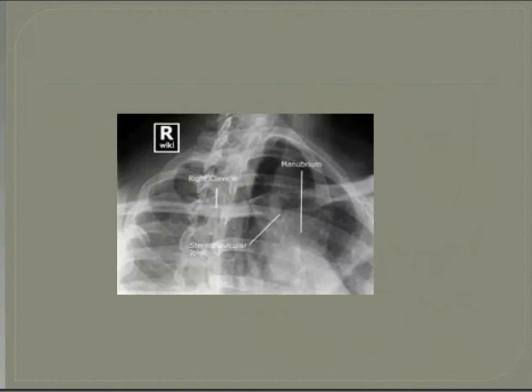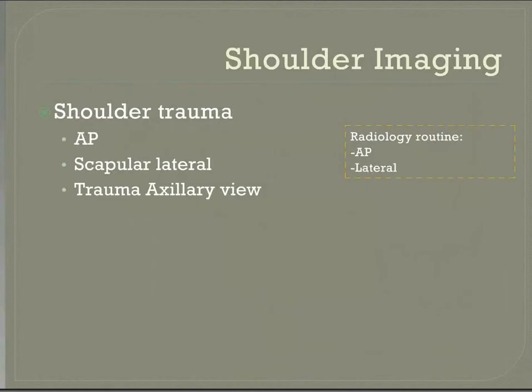And then for shoulder trauma, we do our routine AP and scapulolateral, but also the request was for an axillary view, which would be difficult for a radiographer to perform in a patient that's in a lot of pain, obviously from fracture or other concerns from a dislocation.